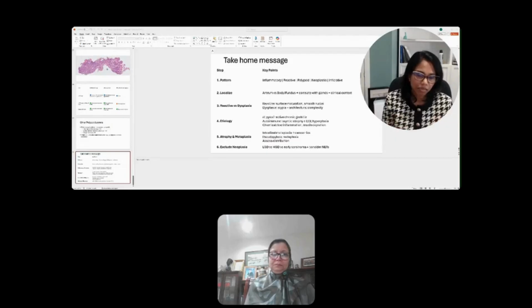But another scenario where I absolutely do H pylori markers or immunohistochemistry is in a post-treated HP gastritis, because the inflammation may have diminished, and post-treatment the H pylori will change morphology. They develop a more coccoid morphology, they're more rounded in appearance, and you won't visually see them. In that scenario, I almost always do an immunohistochemistry, even if this looks completely clean and there's only mild chronic inflammation, because I just want to be absolutely sure.